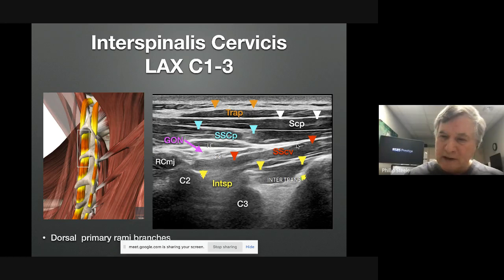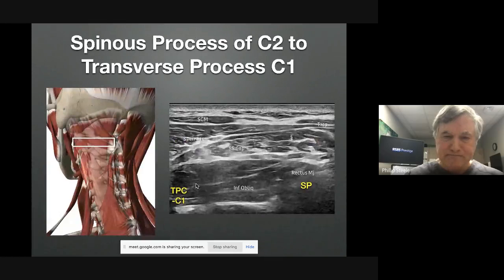And more importantly, you can see the semispinalis cervicis insertion into C2. And this is where your functional exam can play into that as well. So you can do flexion extension to look at this particular muscle attachment, compare left versus right, look for atrophy, and then identify the pathology and make enhancements in your Prolo technique.